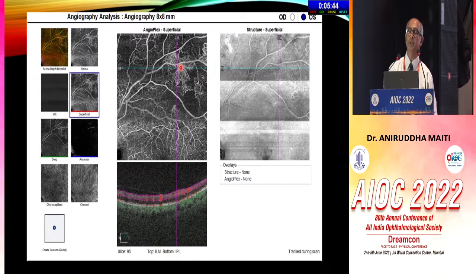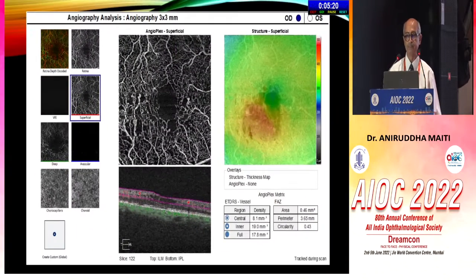So from a patient who would otherwise walk out of your clinic, you're suddenly now considering altering the method of treatment. So this is the importance where OCT angiography helps you to perform tests which you would otherwise possibly not do. For example, even in diabetic patients, a pregnant patient who is diabetic, you may hesitate to do angiograms, whereas here you can do it very easily.